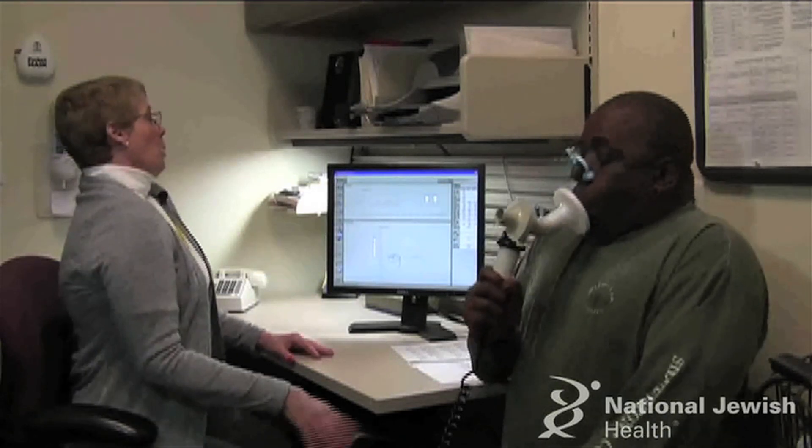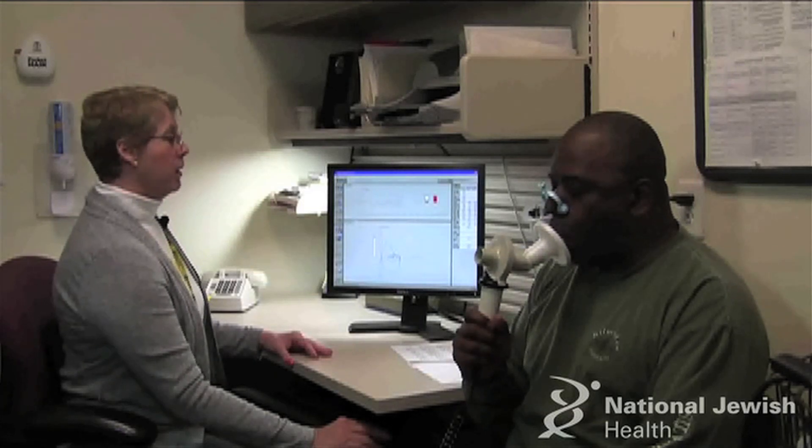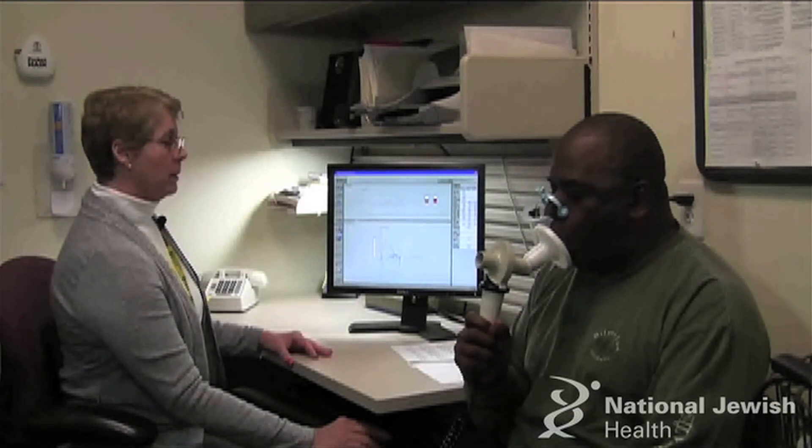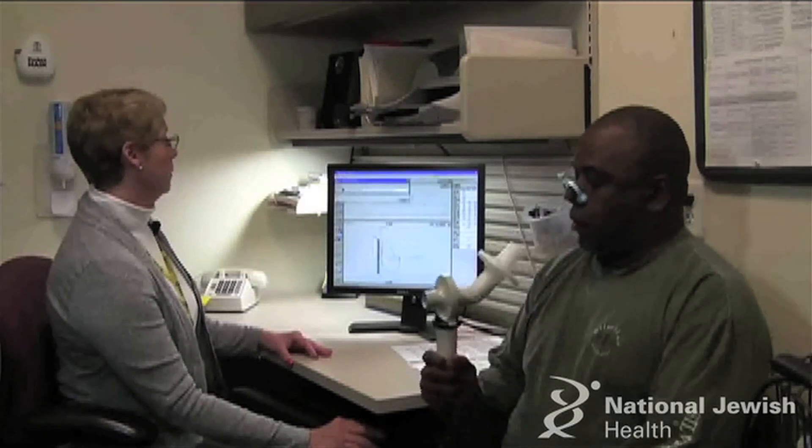Now big breath in! Keep blowing out all the way! Breathe in and come off! Very good.